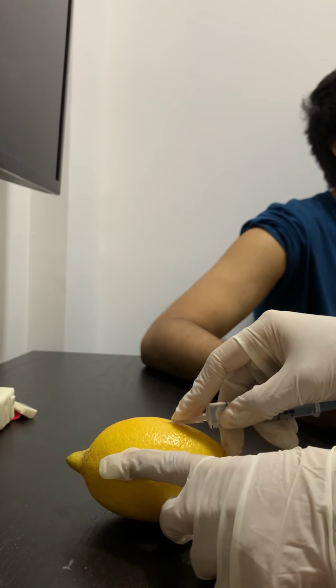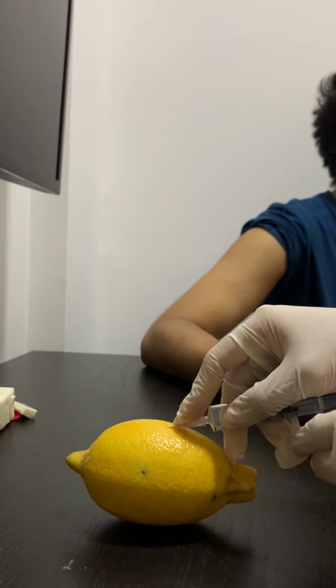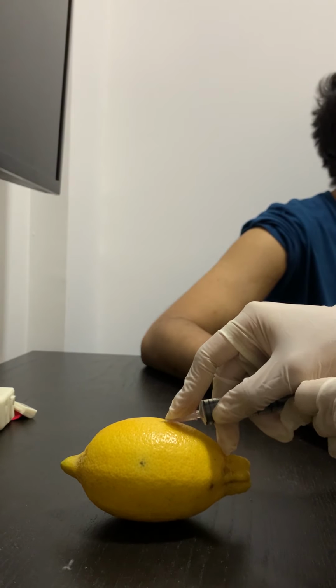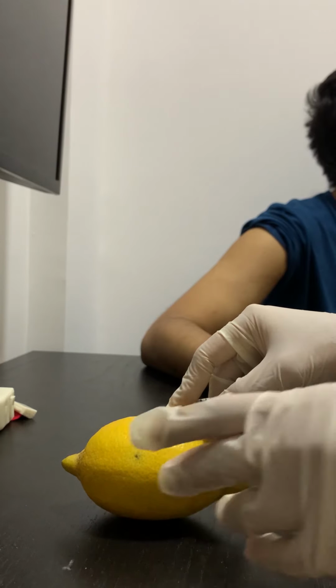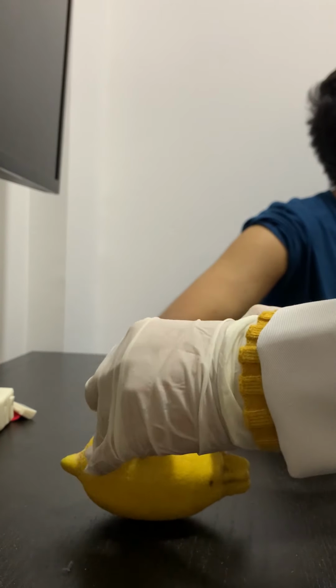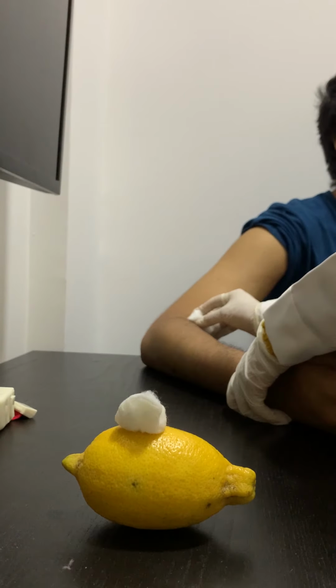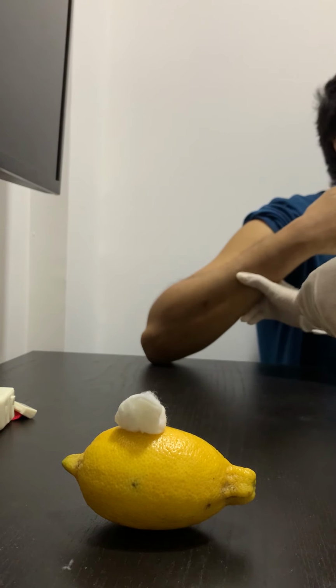It's easily released and we can ask the patient to unclench his fist. And now we advance the medication. Once the medication is advanced, we can apply a cotton at the site of the injection, and then we can withdraw the needle and ask the patient to keep his arm bent for a while.